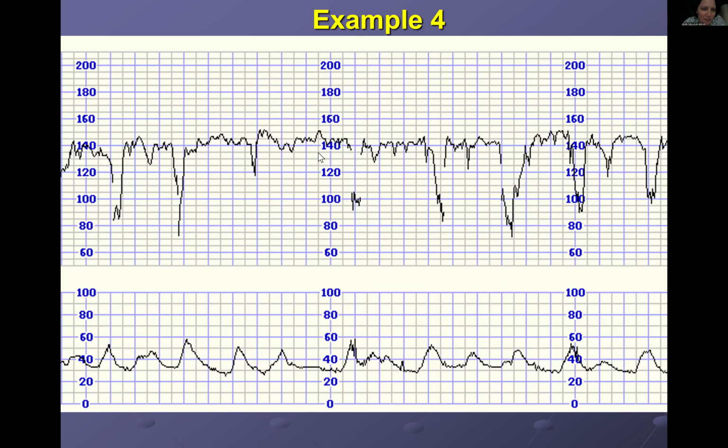What about the contractions? Let me zoom in. She arrived in labor ward only half an hour ago. Okay, the contractions go 1, 2, 4. 1, 2, 3.